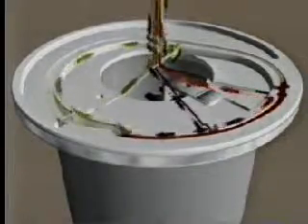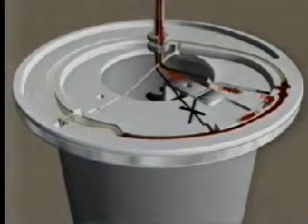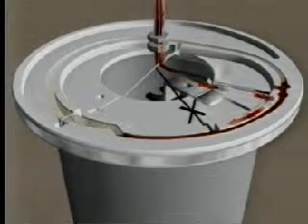In the accumulation phase, mononuclear cells, including peripheral blood stem cells, accumulate in the centrifuge channel. The accumulation of mononuclear cells continues until a predetermined volume of cells is accumulated. This accumulation is affected by the inlet flow rate, which is the rate at which the cells enter the channel, and also by the patient's mononuclear cell precount. When the accumulation phase is complete, the Spectra system automatically initiates the next phase, which is called harvest.